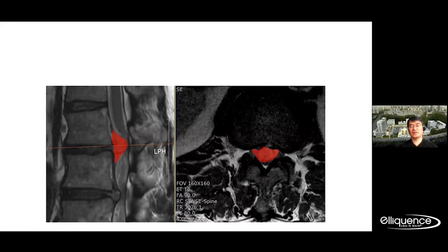So what would be the ideal solution for the treatment? I also have a bunch of experience with thoracoscopic discectomy. Personally, to reach the corner and corner of the disc herniation, you can see the yellow line resecting the corner of the vertebral body. In that procedure, resection of the additional bone margin should be conducted together, right?